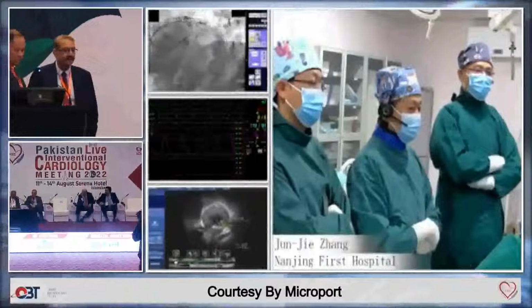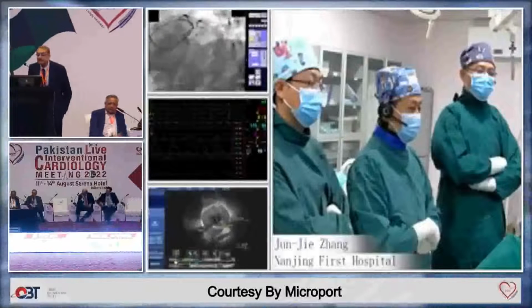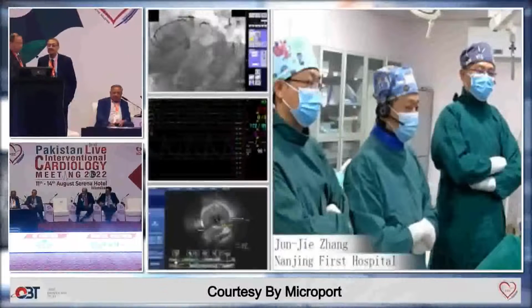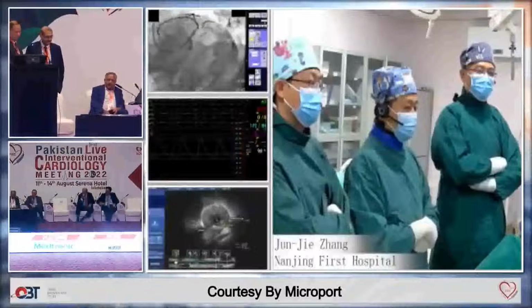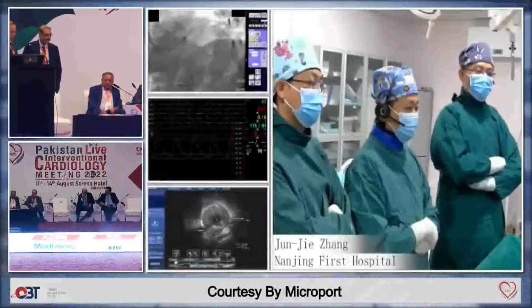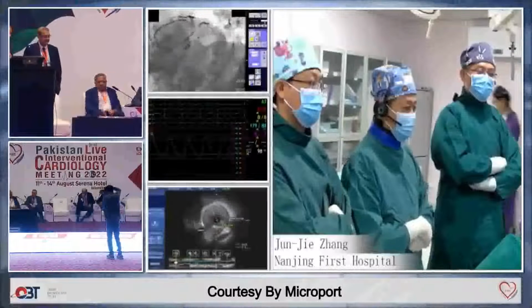I didn't see the amount of calcium, so obviously you're going to do some IVUS imaging of both branches, and if it's calcium, maybe we'll do some plaque modification. Shaoliang just told me you may have a shockwave type of balloon in China now, so it requires plaque modification, IVL if needed, before you do a two-stent strategy.